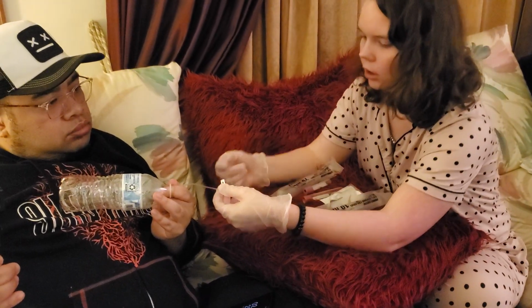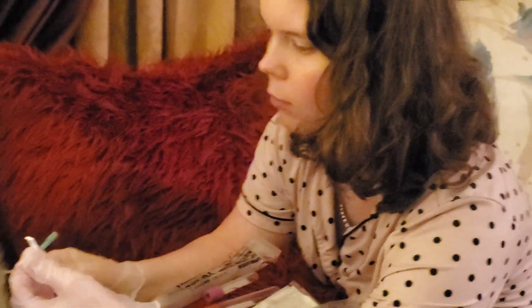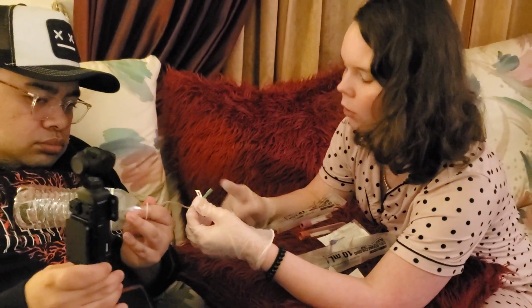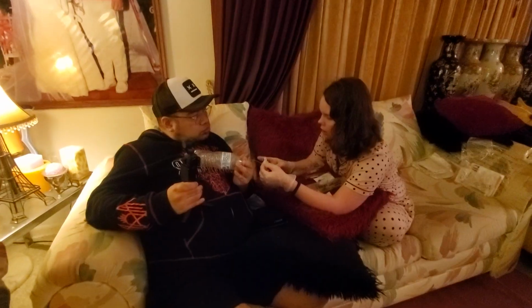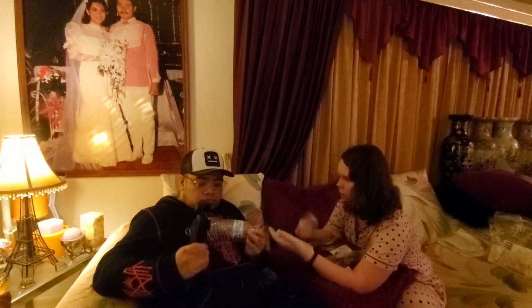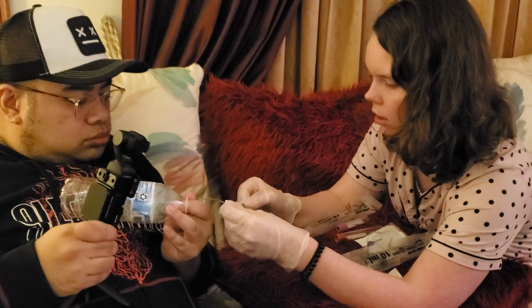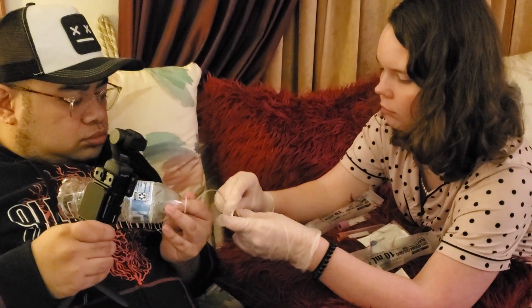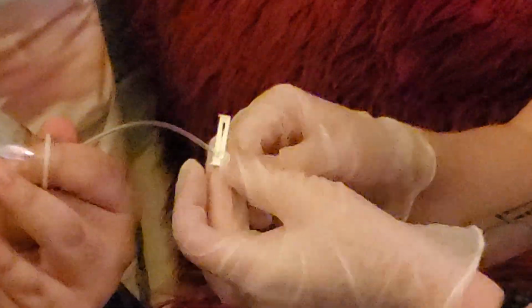Throw that away. I have to be very careful because this goes right to the heart. I have to be as sterile as possible. The only thing that needs to remain sterile is the opening of the cap. So I don't want to hold it like this because then it's touching my palm and that's breaking sterility, potentially leading to an infection. I'm going to move this up a little bit. Okay. That wasn't much.